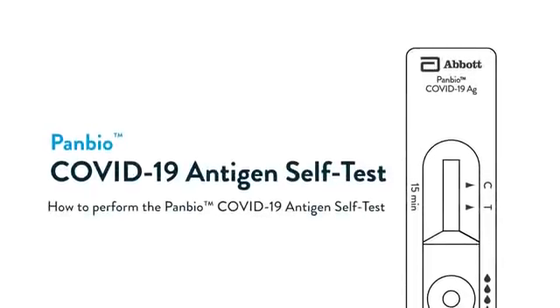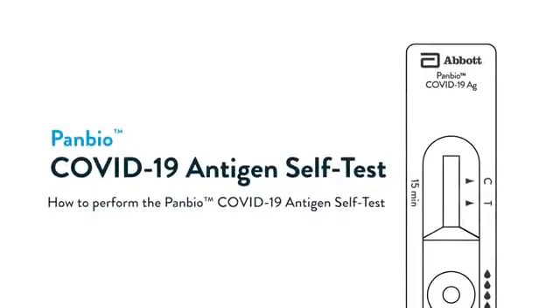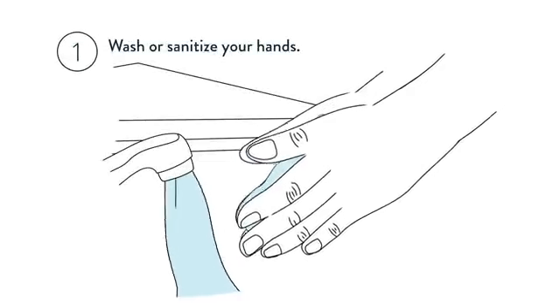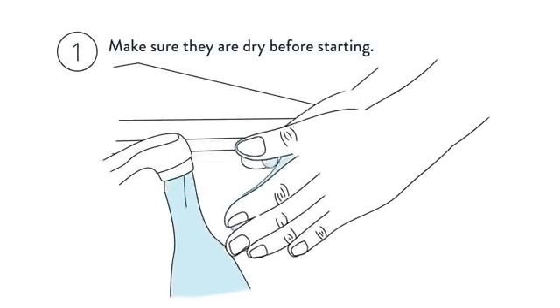How to perform the Panbio COVID-19 Antigen Self-Test. Wash or sanitise your hands. Make sure they are dry before starting.